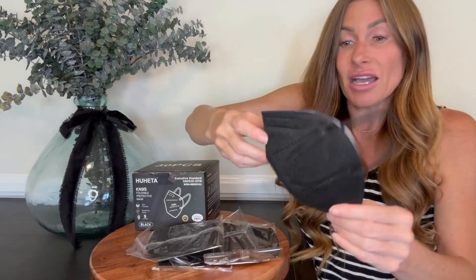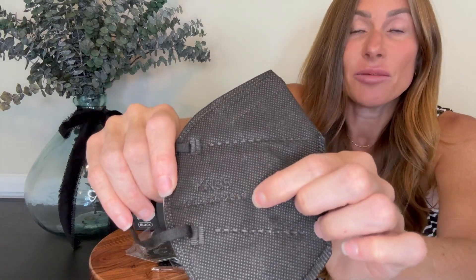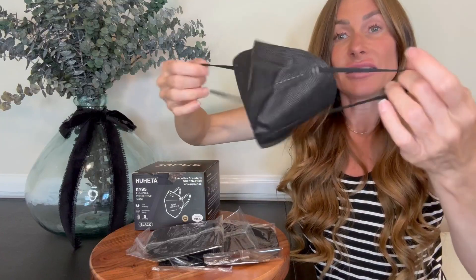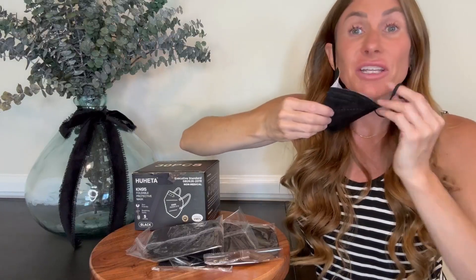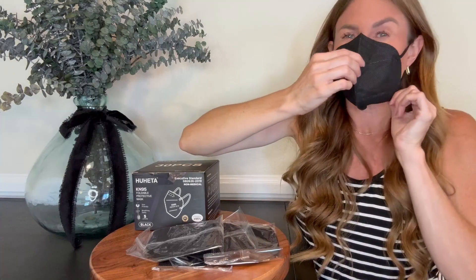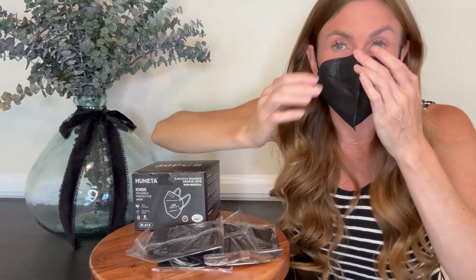These are the KN95 and you'll see it printed right there on the mask. It has some nice ear straps which have elastic to them, and you can put them behind your ears. I feel like they have enough elasticity that they give a very tight pull and the mask feels secure.